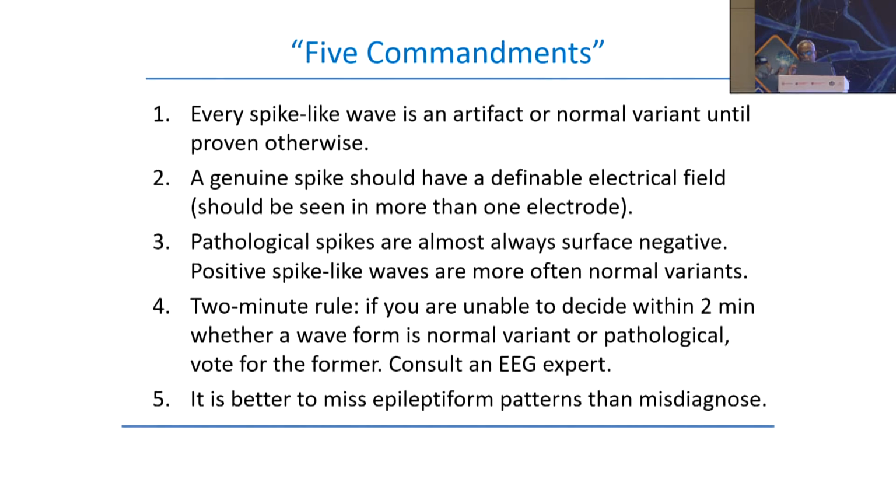And in each one of these steps, for example, as I mentioned, the 4th step is where most of the mistakes in EEG reading are made. So I'm going to provide you with this, by John Dunn and myself. He's an Australian EEGer. Both of us had training at the Mayo Clinic, and we tried to name it like 10 commandments; here there are 5 commandments which each of the new EEG readers should understand.